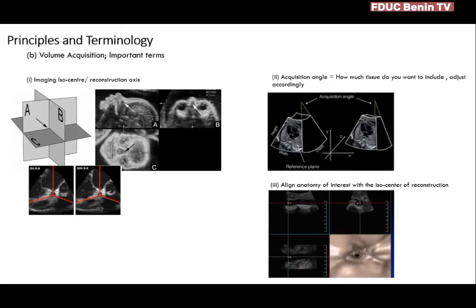That point is a dynamic point. The operator has the privilege of moving that point based on the machine setting. So Dr. Sheila is going to be doing the live demonstration, and he might be able to reflect on this.